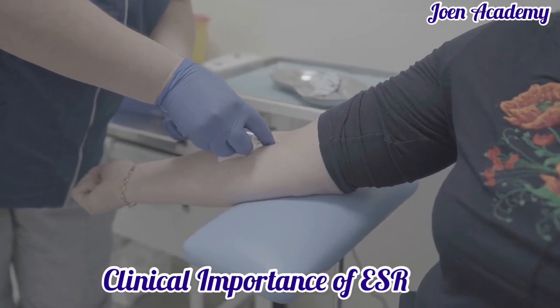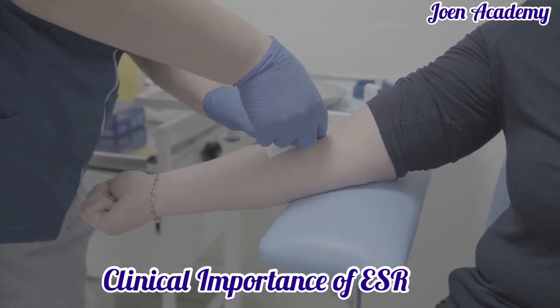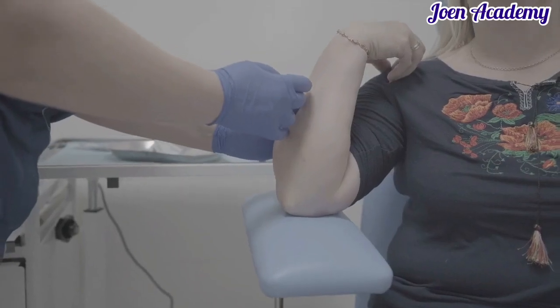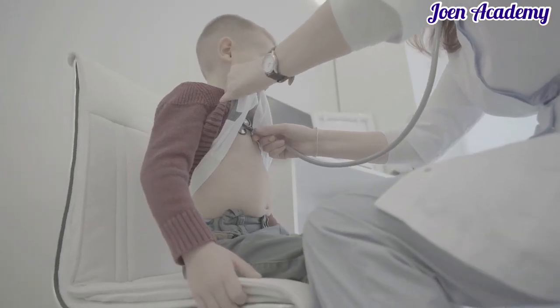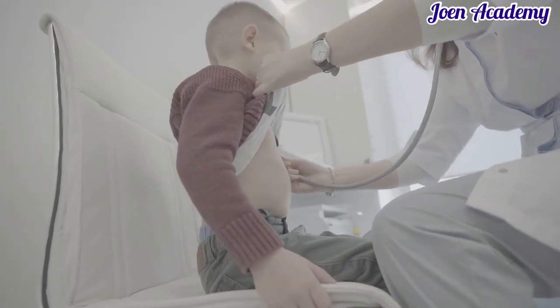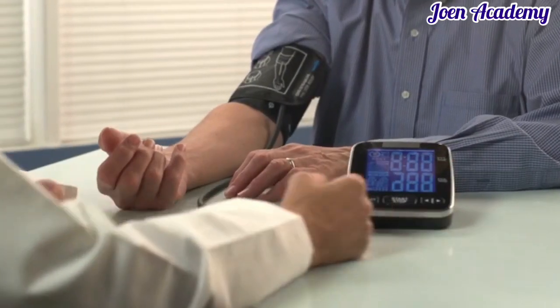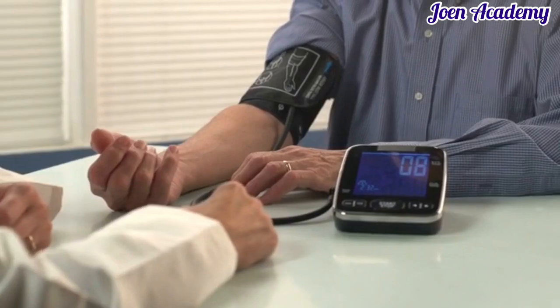Determination of erythrocyte sedimentation rate is of great importance clinically. It is not costly to determine, and it is really helpful in diagnosis as well as prognosis of diseases. Diagnosis of disease simply means detection of presence of diseases, whereas prognosis means monitoring the course of diseases and response of the patient to therapy.